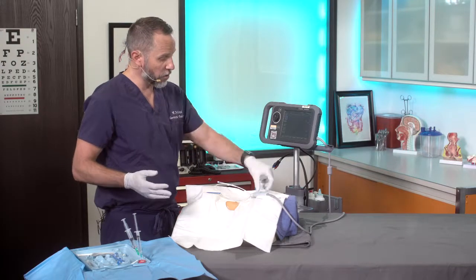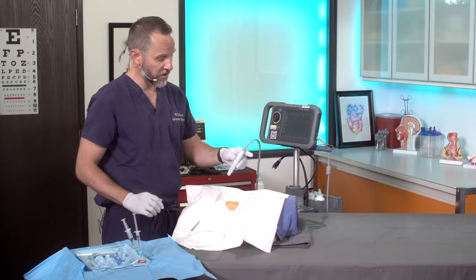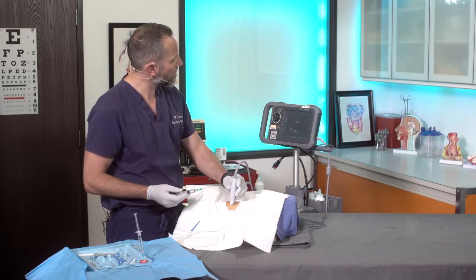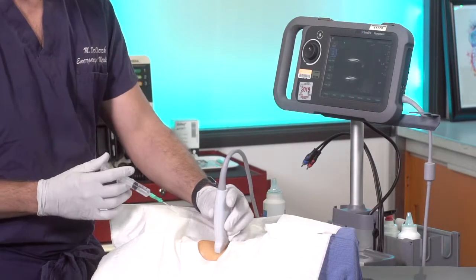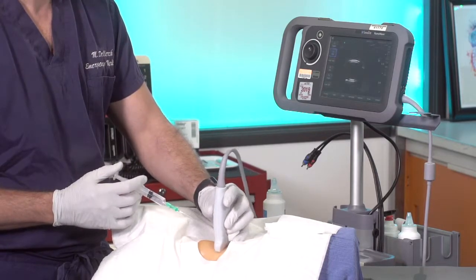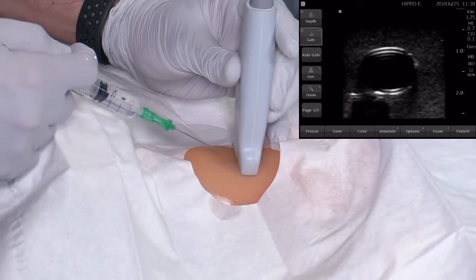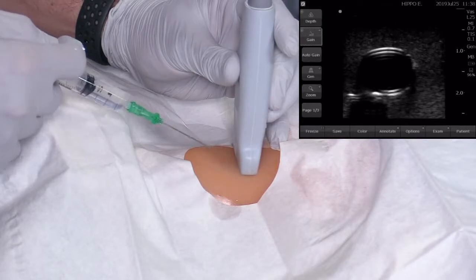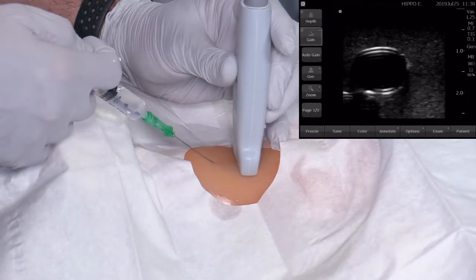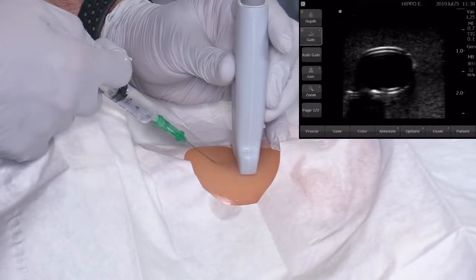Now that we're set up and I know what I'm looking for, I'll take my ultrasound and move the guide wire to the lower end of my sterile field. With the finder needle, you're going to do the exact same thing as before: find on your ultrasound where the vein is, confirm it's the vein by making sure it collapses when you put pressure on it, and center it. You can find the center on your ultrasound. You're not putting the needle right where the ultrasound probe is — you're going about 45 degrees, looking toward the ipsilateral nipple, and you introduce it about two centimeters away from the ultrasound probe, because that's approximately how deep the vessel is.